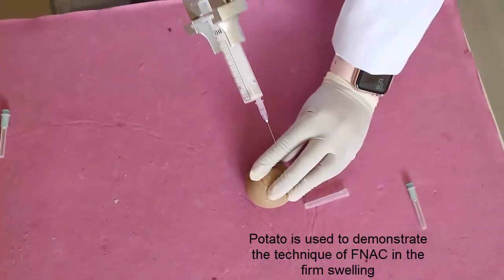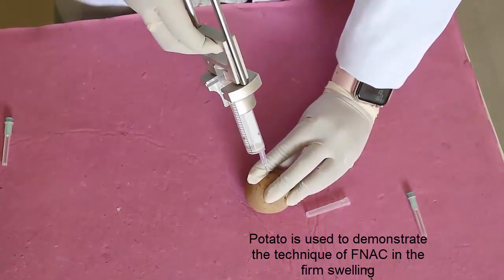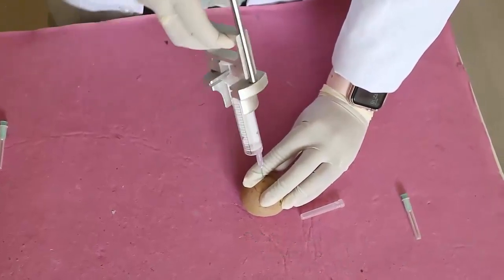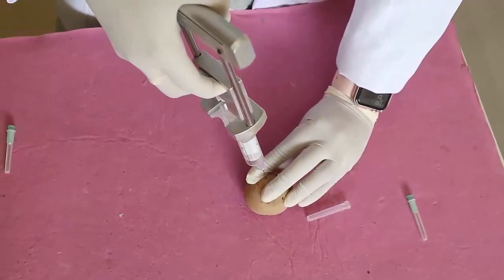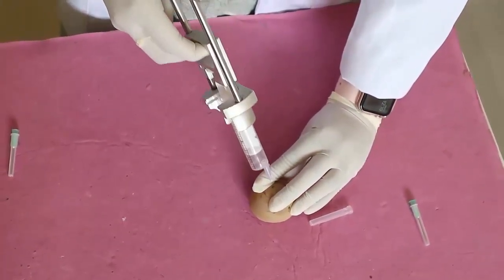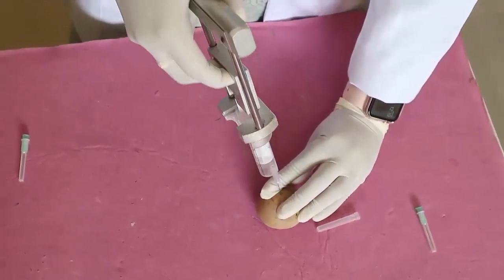A negative pressure is applied in order to hold the tissue against the sharp cutting edge of the needle along the track as the needle advances through the tissue. Repetitive back and forth movement is done within the lesion in multiple directions with the negative pressure maintained. The negative pressure must be released before the needle is withdrawn.